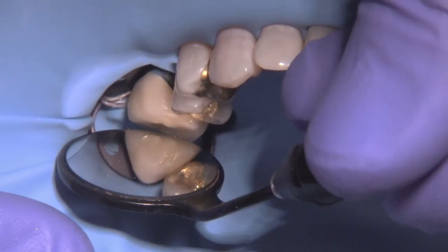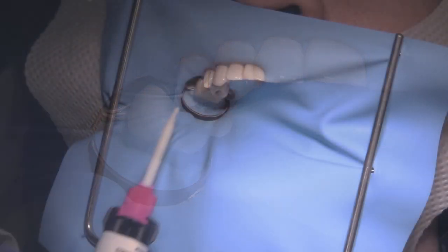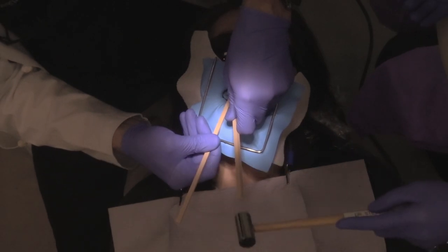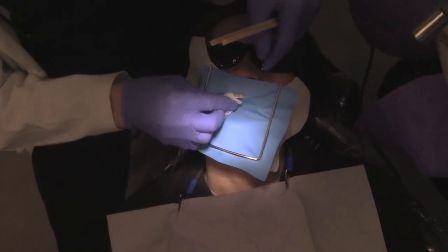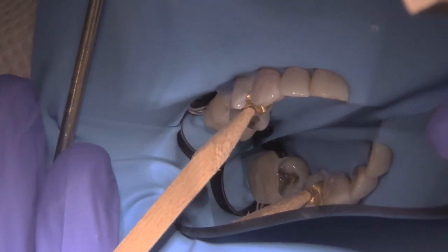After this we sandblast, try them in again, and sometimes you'll find they go completely into their final resting place, in which case you may need to pop them out with an instrument. I'm going to utilize a low film thickness cement like a glass ionomer — you could also use zinc phosphate or a seromer, which have very low film thicknesses. We tap them into position using birchwood or orangewood sticks with a little malleting, which vibrates out the cement and ensures the castings get fully seated. Once fully down and no more excess cement comes out, hold them in position for another 30 seconds.